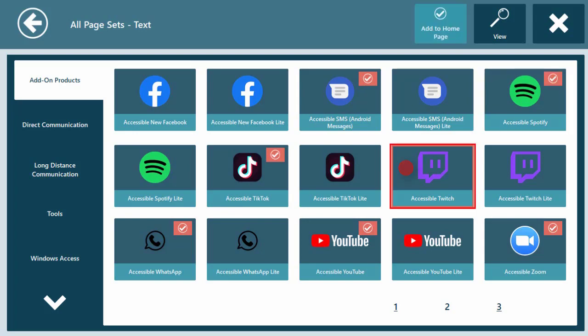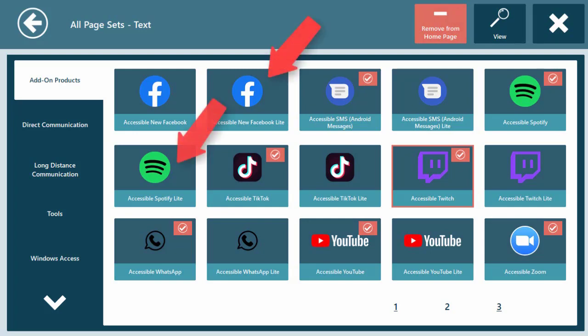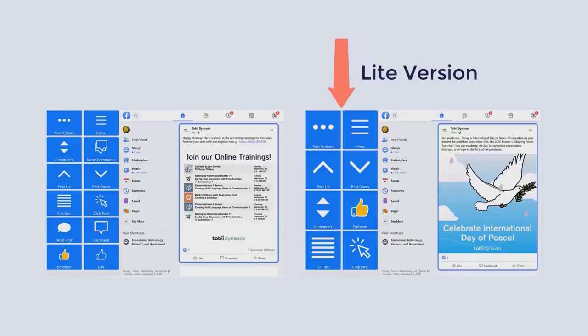Repeat this for all the apps you wish to add to your Communicator 5 Homepage. Note that most of the apps have their Lite versions available. The Lite version provides fewer and larger buttons on each screen for easier access when needed.